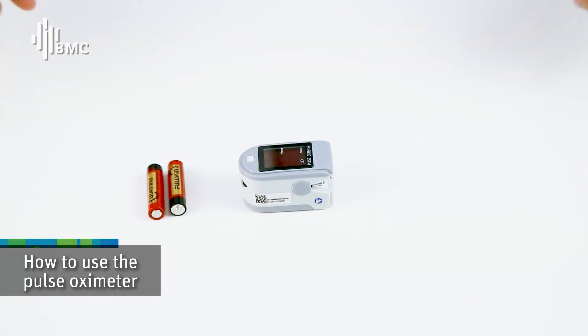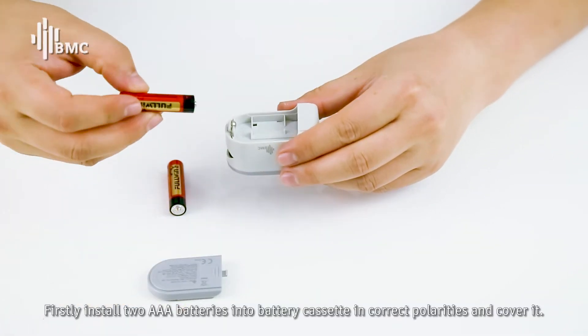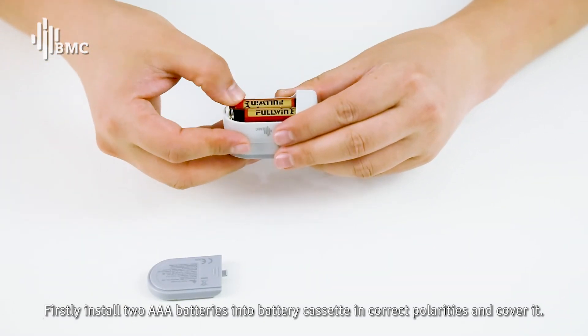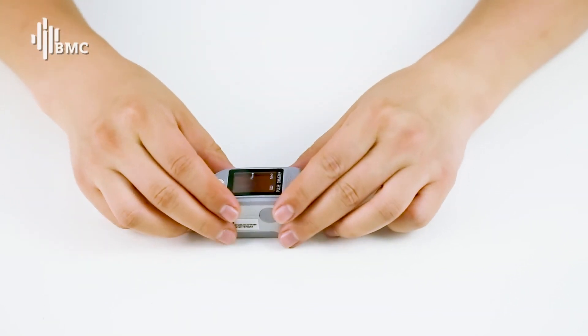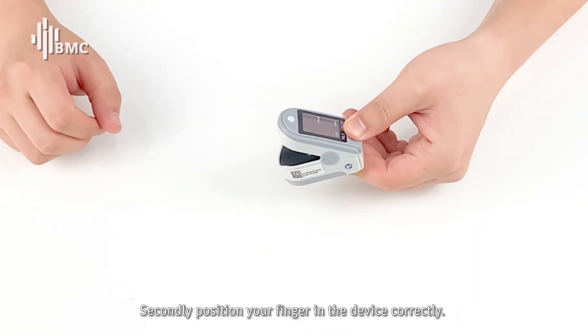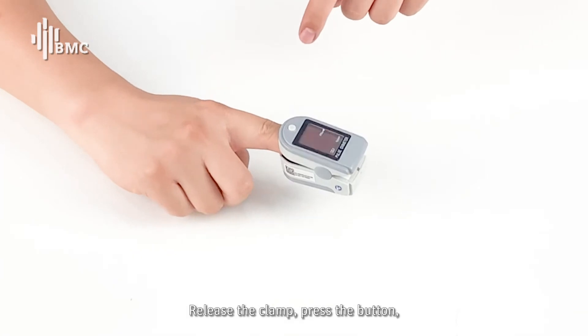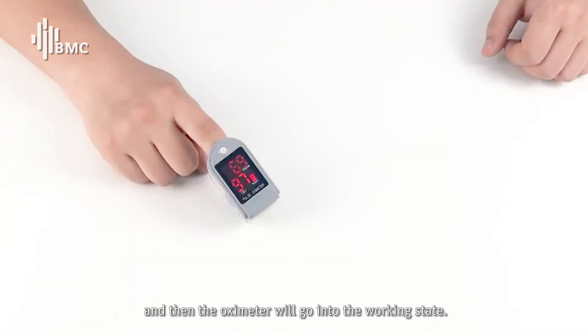How to use the POS OXYMETA? Firstly, install two AAA batteries into the battery cassette in correct polarities and cover it. Secondly, position your finger in the device correctly. Release the clamp, press the button, and then the OXYMETA will go into the working state.